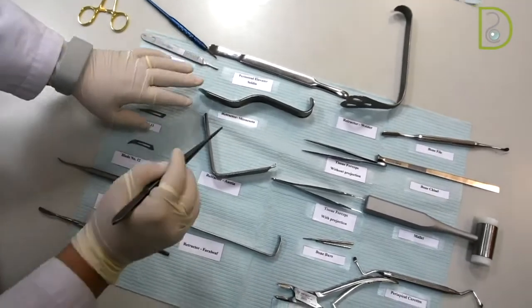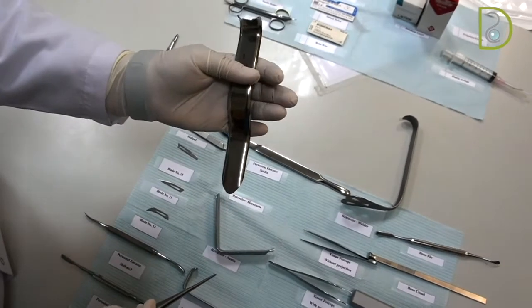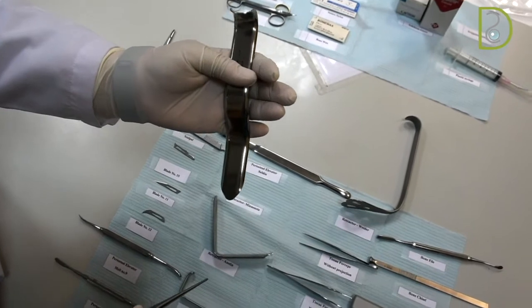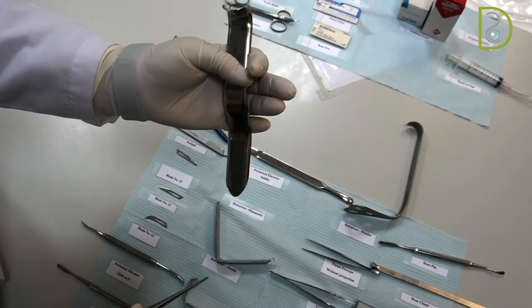Now we come to the retractors. Retractors, the main purpose for them is to retract the tissue away from the surgery, and to make these tissues safe from any sharp edges or any burrs or cutting instruments during the surgical procedure.